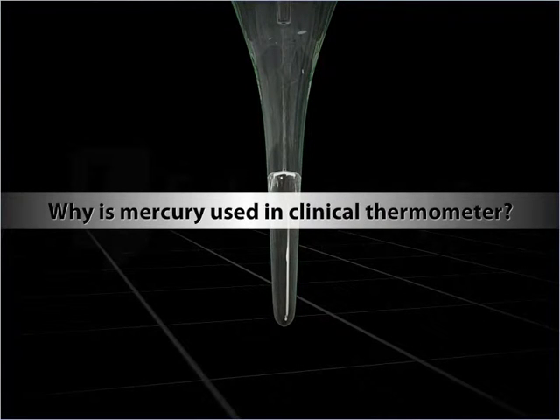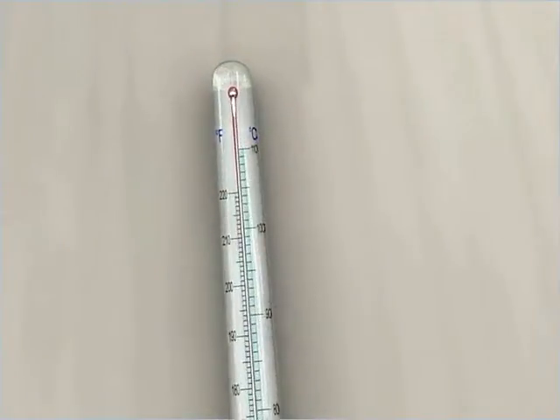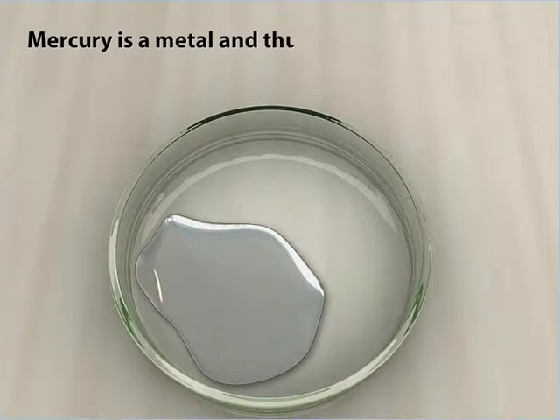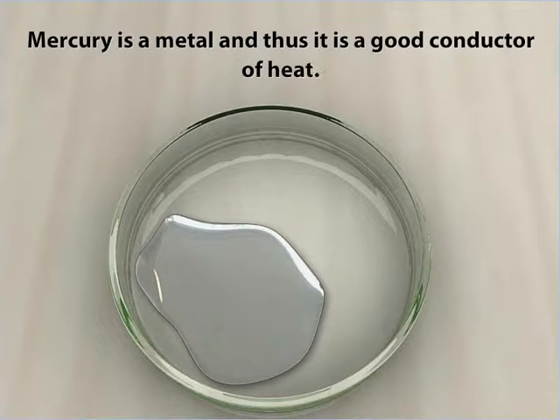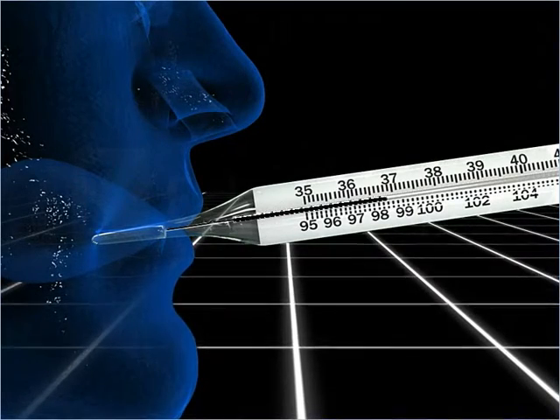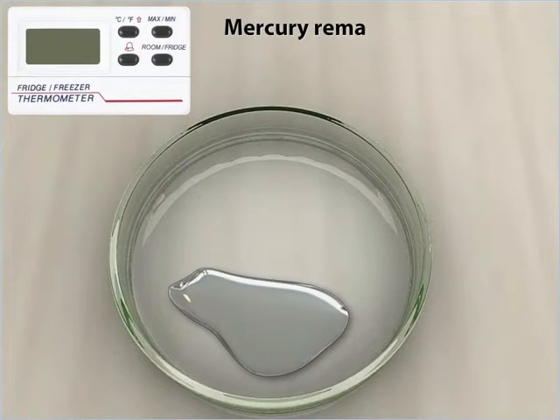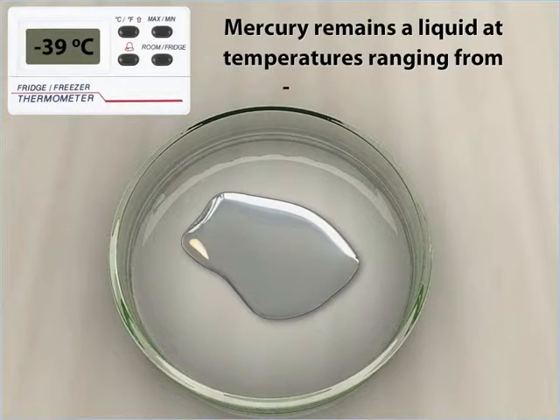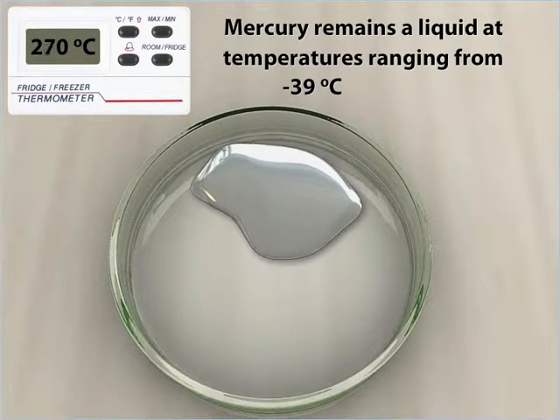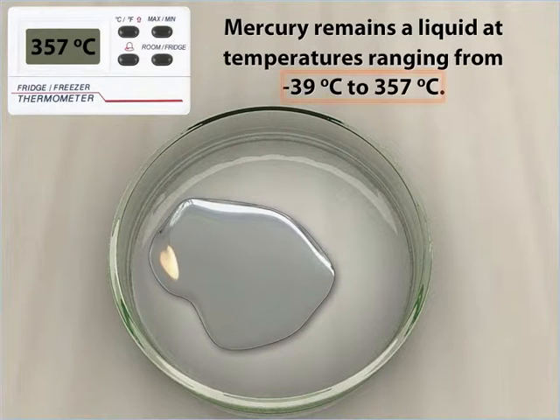Why is mercury used in a clinical thermometer? Mercury is used in clinical thermometers as well as other thermometers for a number of reasons. First, mercury is a metal and thus it is a good conductor of heat — it starts to expand instantly on placing the thermometer inside the mouth, and the expansion can be seen as a rising thread of mercury. Second, mercury remains a liquid at temperatures ranging from minus 39 degrees Celsius to 357 degrees Celsius, and hence it can serve to measure a wide range of temperatures.